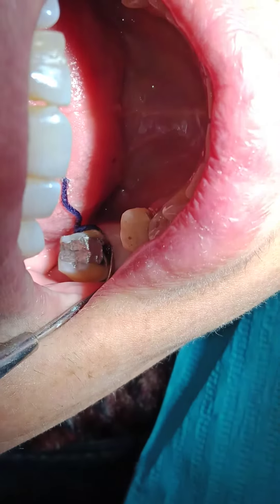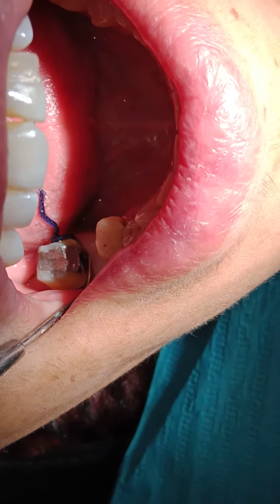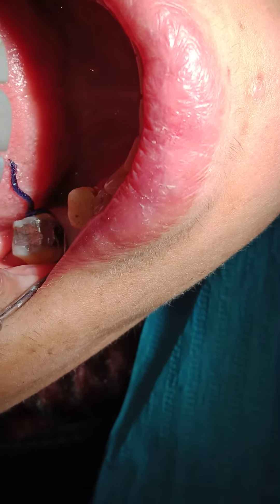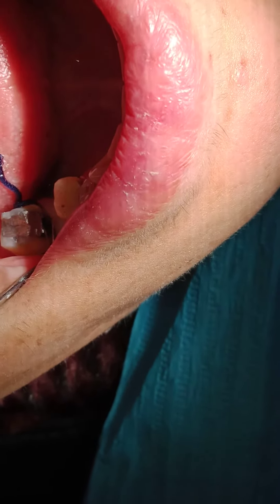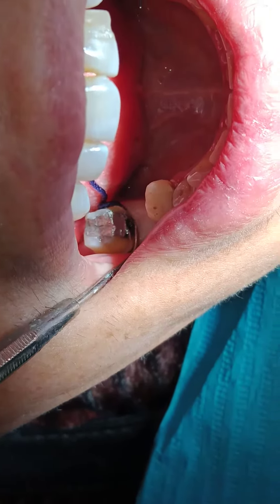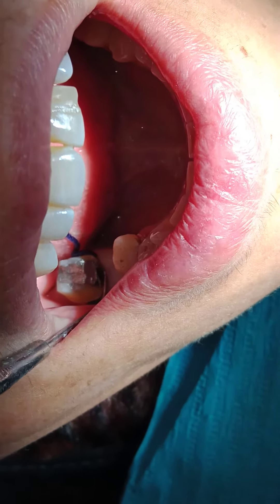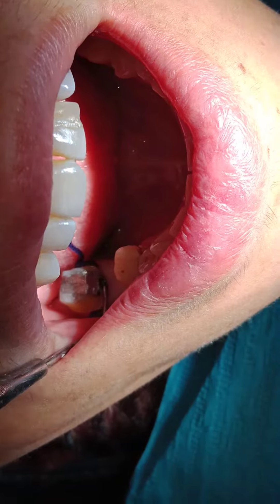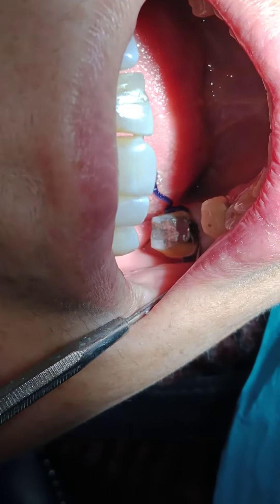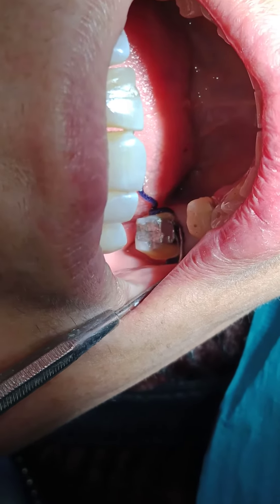A third function of this retraction cord is that it will be a guide for how much I can go apically, because this crown has not had any gingivoplasty or any gingival surgeries. You didn't do any crown lengthening or soft tissue lengthening. So this will be a guide on how much pocket do I have left. Now in the area of the filling, you don't see the retraction cord — maybe it's not very clear on the camera, but the student doesn't see any trace of the retraction cord. The retraction cord is inside the pocket.